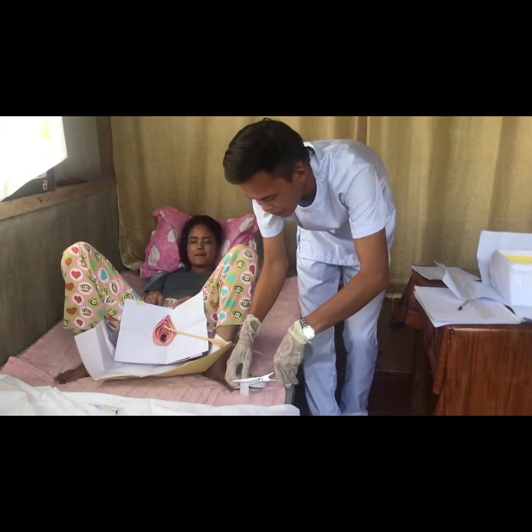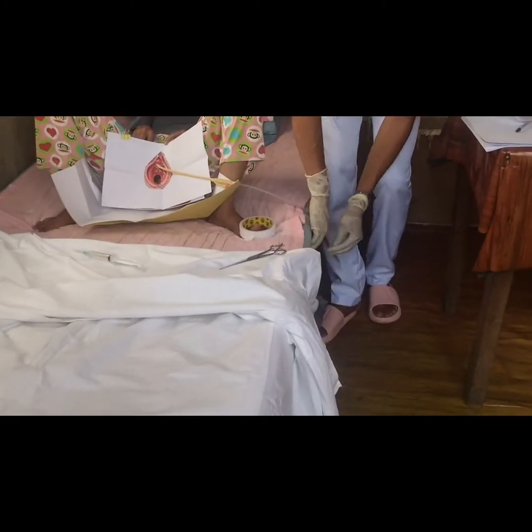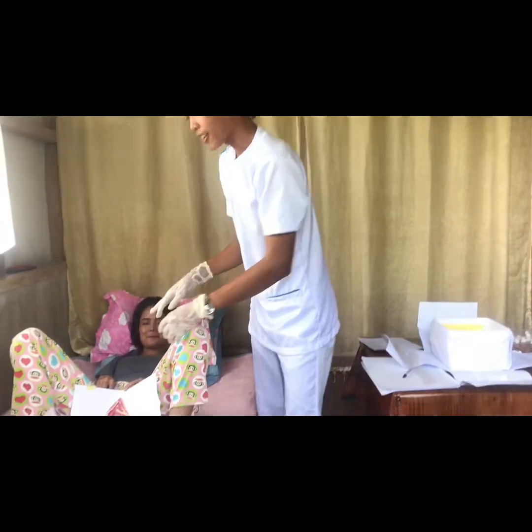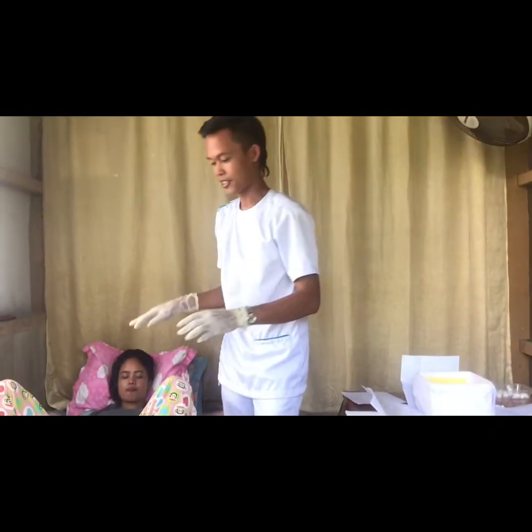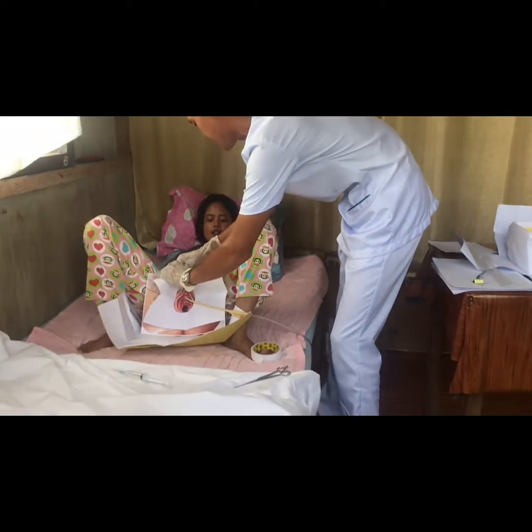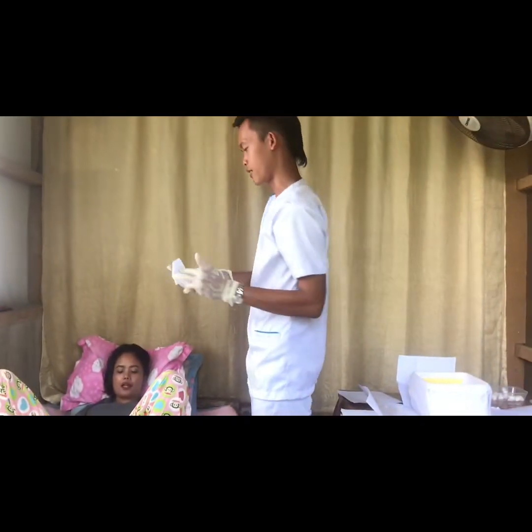You okay, ma'am? Yes. Okay. Everything's well? Yes. So after we hold the urine bag of the patient, I'm going to remove the inserted catheter. I'm going to remove it, ma'am. Okay. Please hold on. And then after that, we're going to dispose of the catheter.